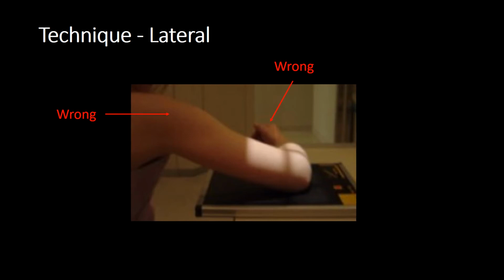The best way to allow for good visualization of the radial head from being superimposed over the proximal ulna is actually to take a 15-degree pad and position it under the pronated hand, ensuring that the widest portion of the 15-degree pad is towards the fingertips and the thinnest portion is towards the wrist. By elevating the wrist 15 degrees, it allows for a good visualization of the radial head and neck, and it doesn't hurt the patient.